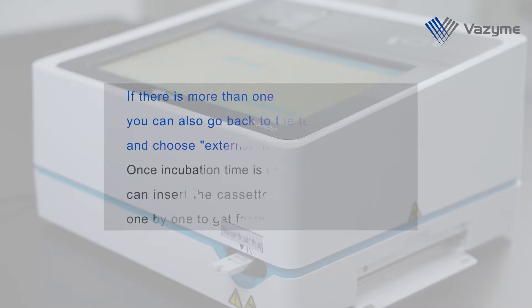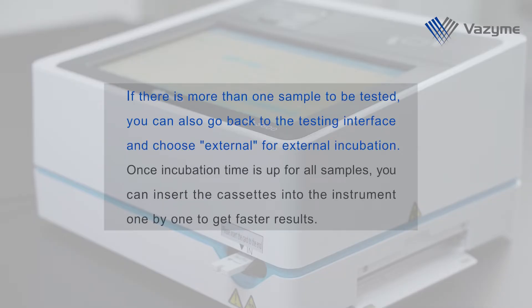If there is more than one sample to be tested, you can go back to the testing interface and choose External for external incubation. Once incubation time is up for all samples, you can insert the cassettes into the instrument one by one to get faster results.